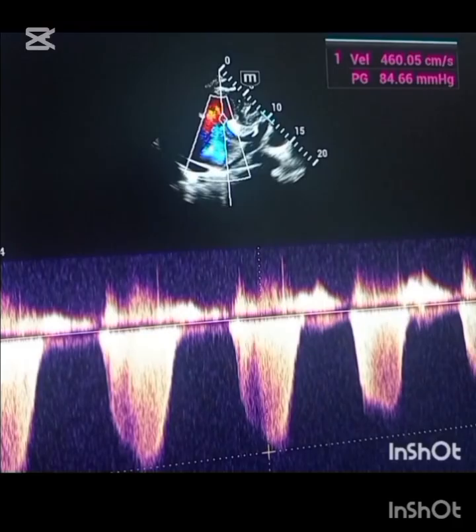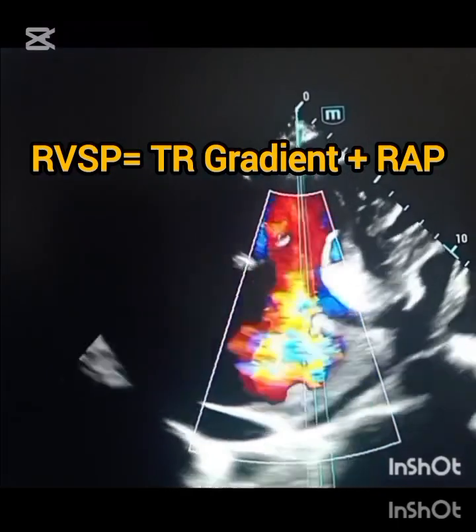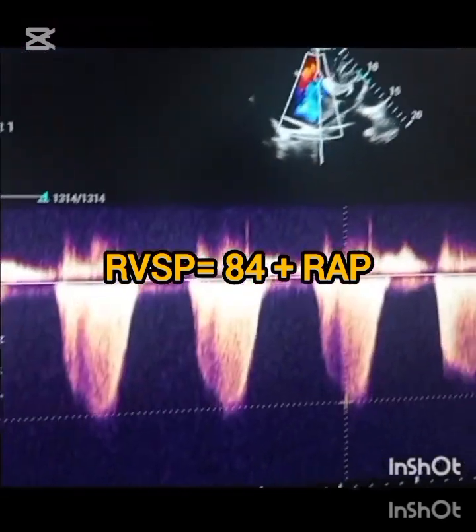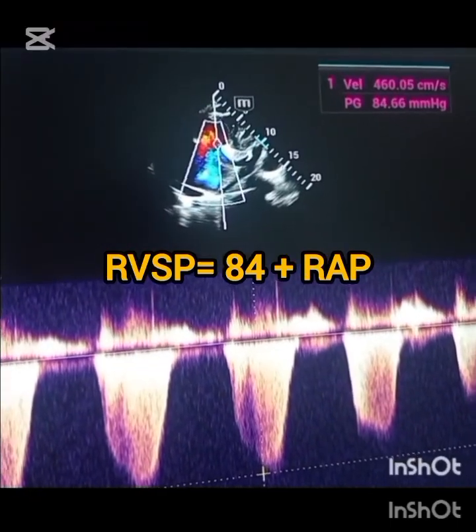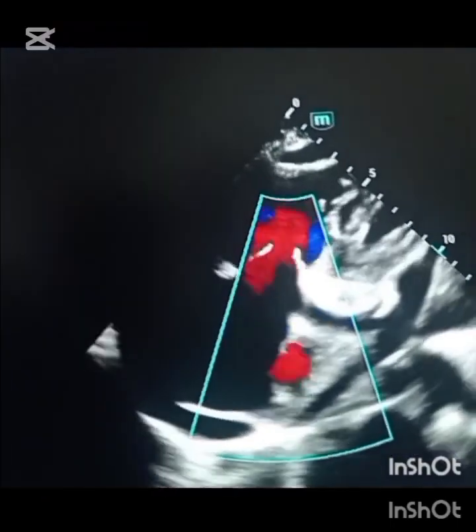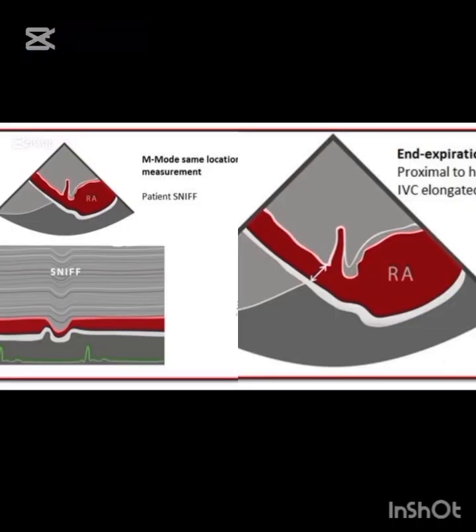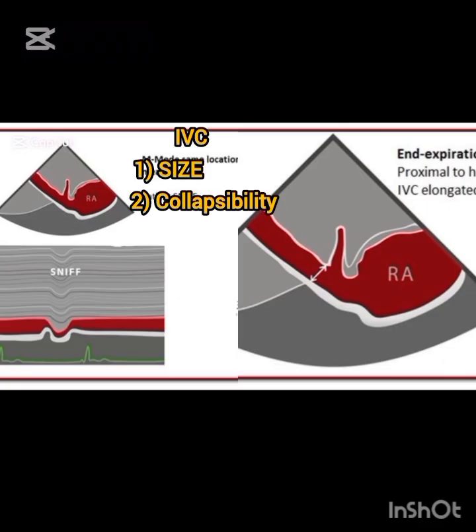Now we have the tricuspid regurgitation velocity and gradient. We add the right atrial pressure — the second component — to this TR gradient to obtain the right ventricular systolic pressure. To calculate right atrial pressure, we need to look at the inferior vena cava. We assess two things in the IVC: first, the diameter — is it enlarged or normal in size; and second, is it collapsible or does it show poor or absent collapsibility.